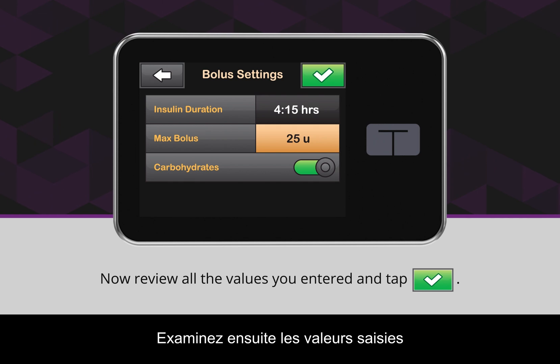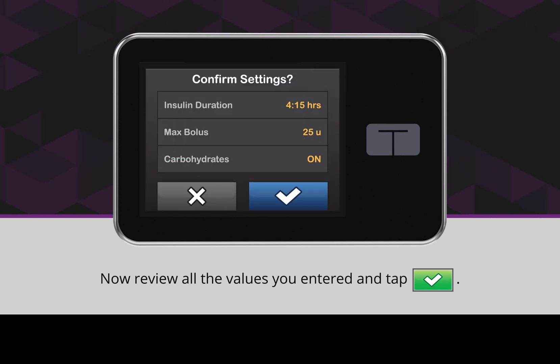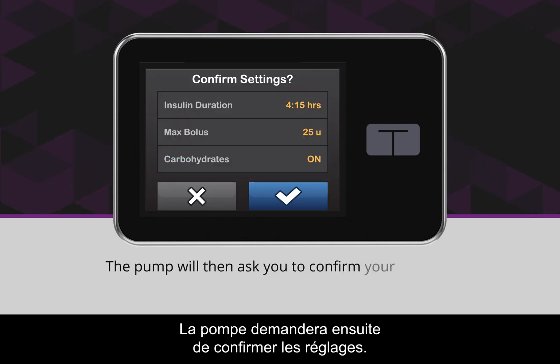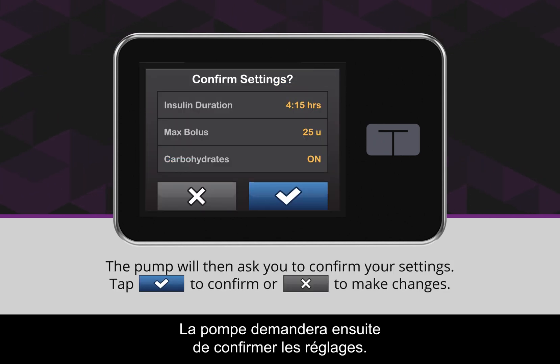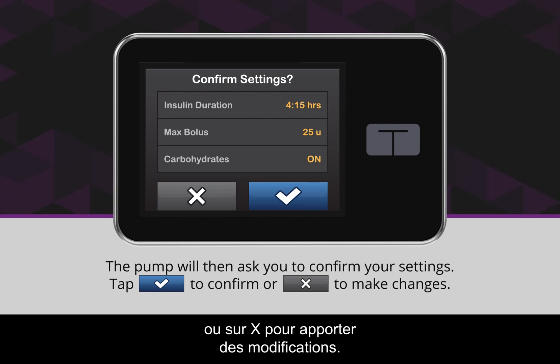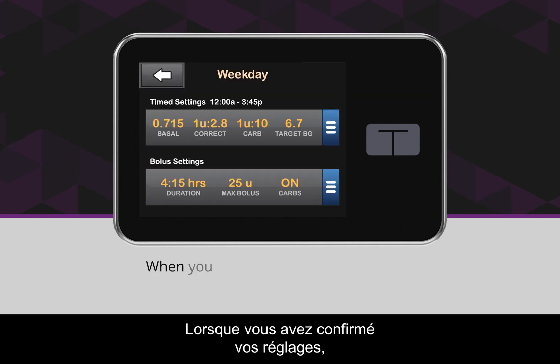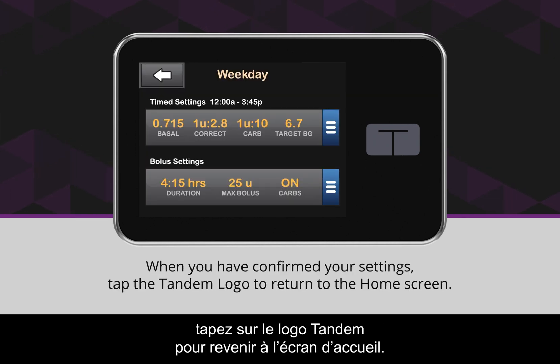Now, review all the values you entered and tap the green checkmark icon. The pump will then ask you to confirm your settings. Tap the blue checkmark icon to confirm or the X icon to make changes. When you have confirmed your settings, tap the Tandem logo to return to the home screen.